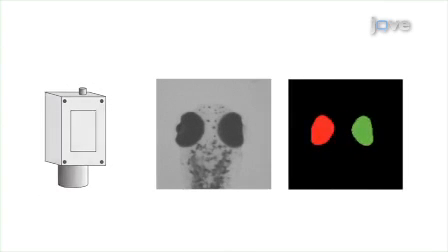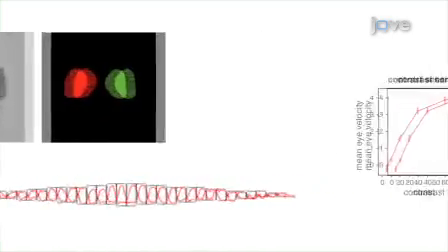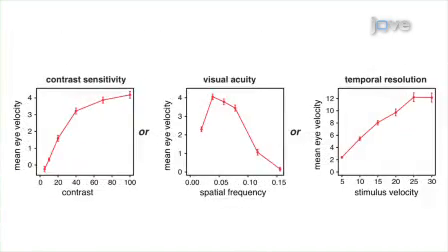Eye positions are then recorded and analyzed automatically by the VisioTracker software package, which also calculates eye velocities in real time. The final step is to process obtained data, relate eye velocities to the properties of the visual stimulus, and calculate average eye velocity and standard error for each experimental condition.